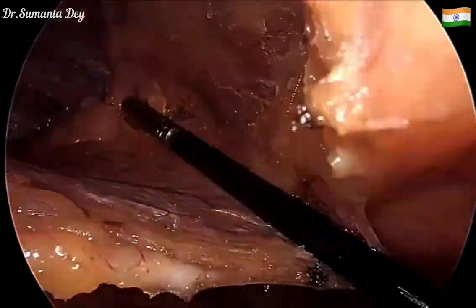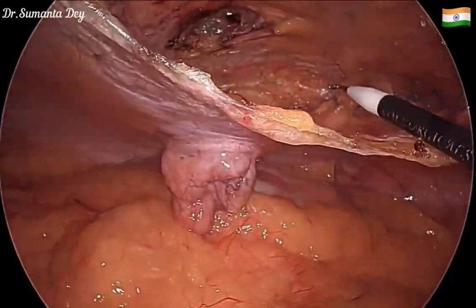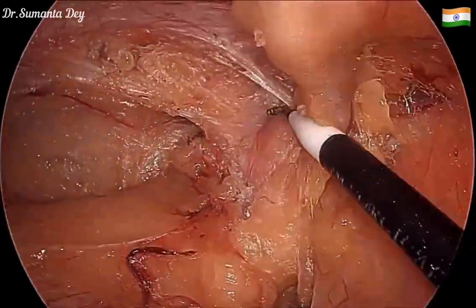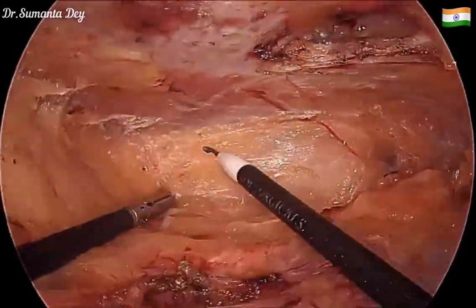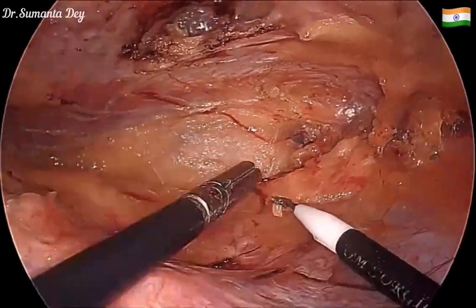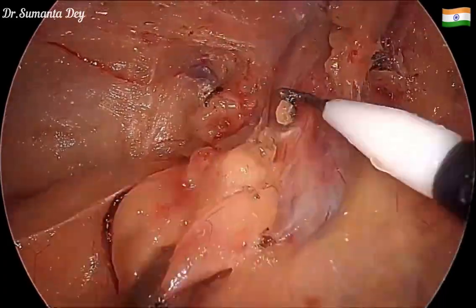I'm now assessing whether the dissection is adequate. The dissection is almost complete — the defect is nicely seen, and the preperitoneal plane creation is done.